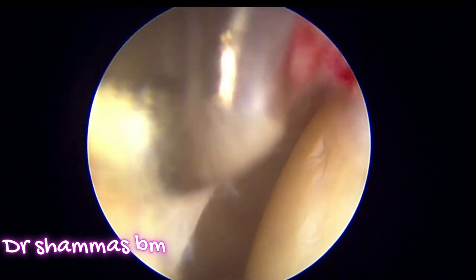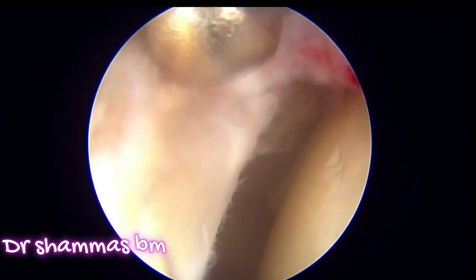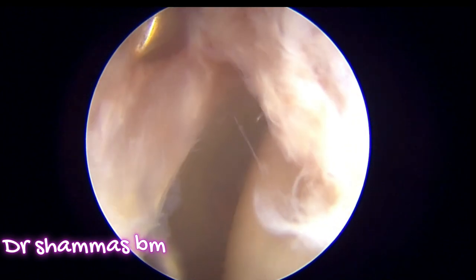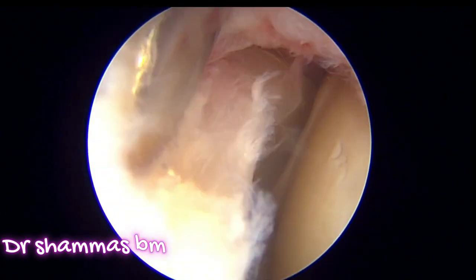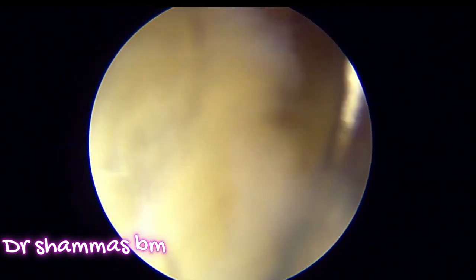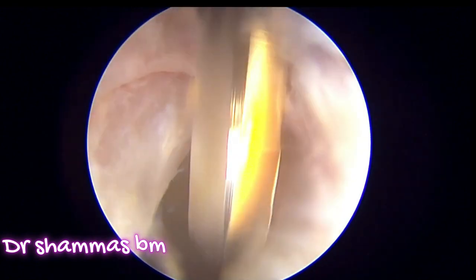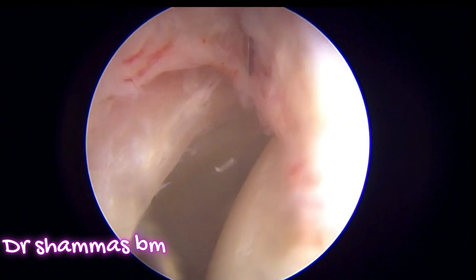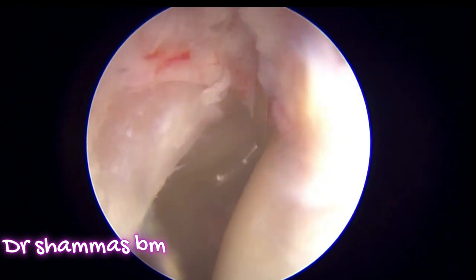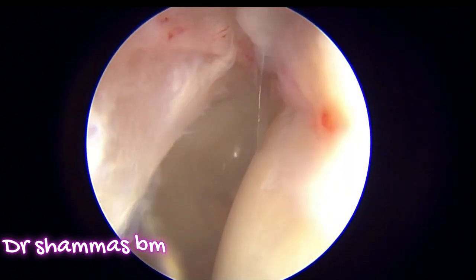Carefully, slowly and steadily use the elevator to clear the soft tissues and tap on it so that you can elevate the labrum from the bone. You need to have an orientation of where and how to elevate. Slowly elevate the labrum along the pincer lesion. Here I am again introducing the knife because I want a little more exposure of the joint. Now you can see that the labrum is pretty much elevated from the pincer lesion and we can proceed with removing the lesion.